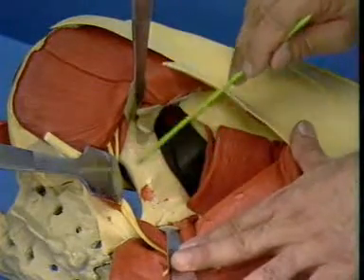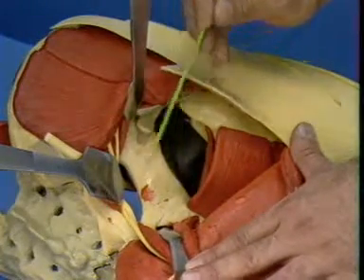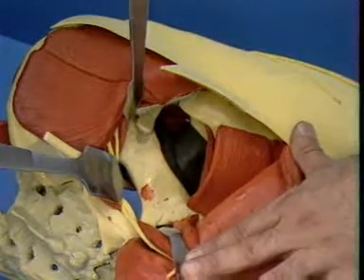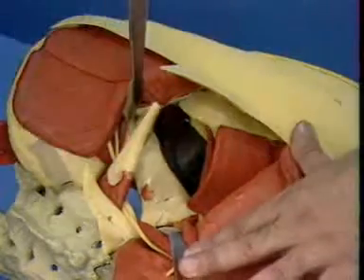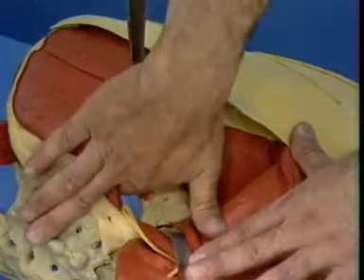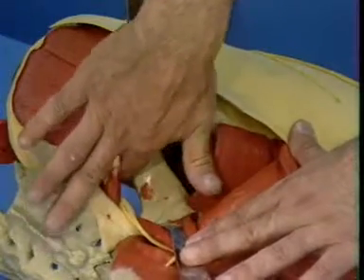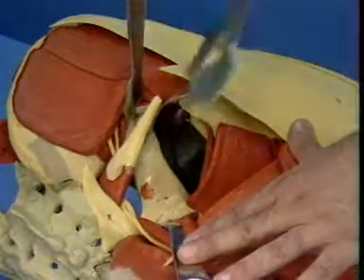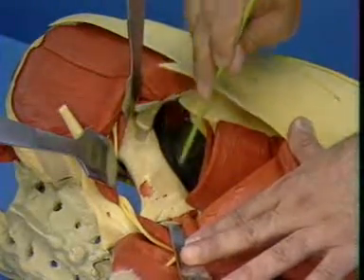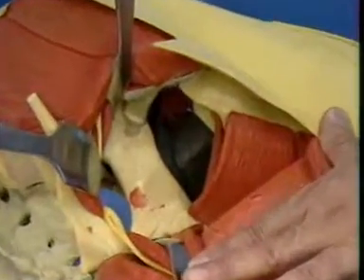The entire retroacetabular surface is now exposed, from the superior portion of the ischial tuberosity to the inferior ilium. The quadrilateral surface and pelvic brim can be accessed by palpation through the greater sciatic notch. The interior of the joint can be visualized by performing a capsulotomy along the rim of the acetabulum.